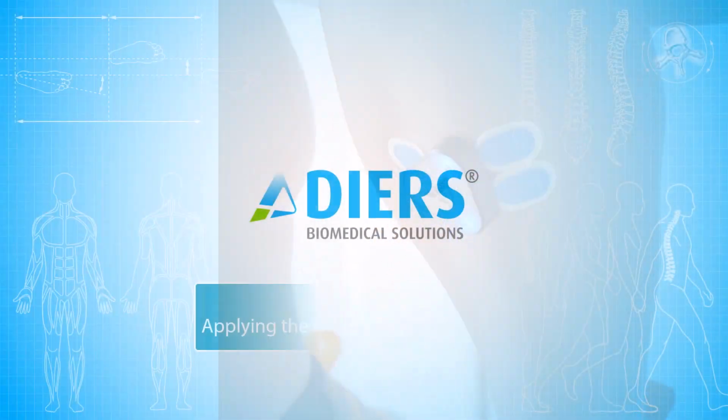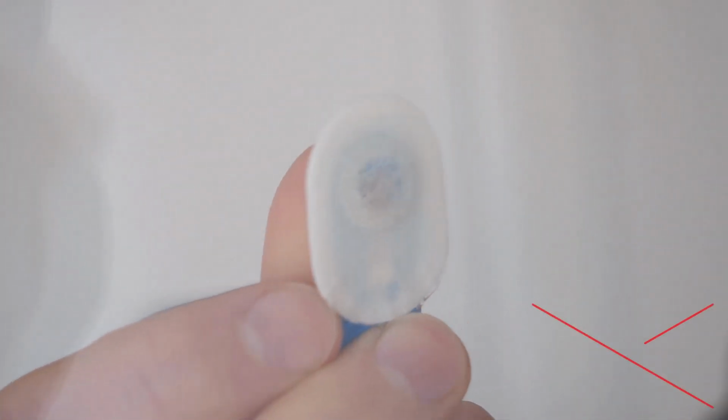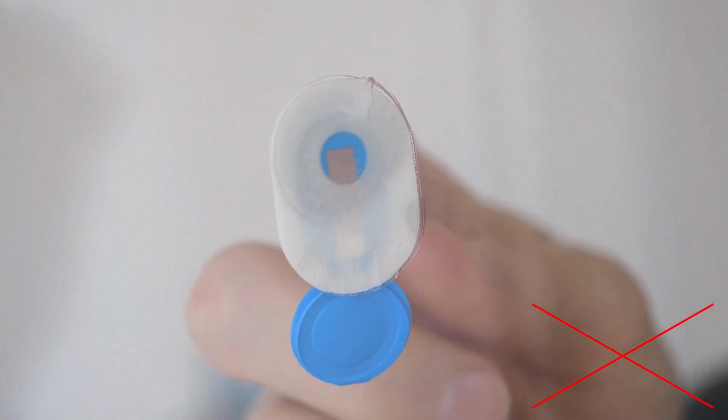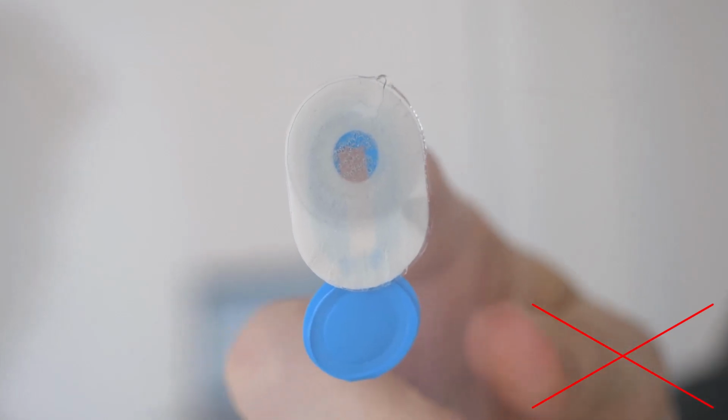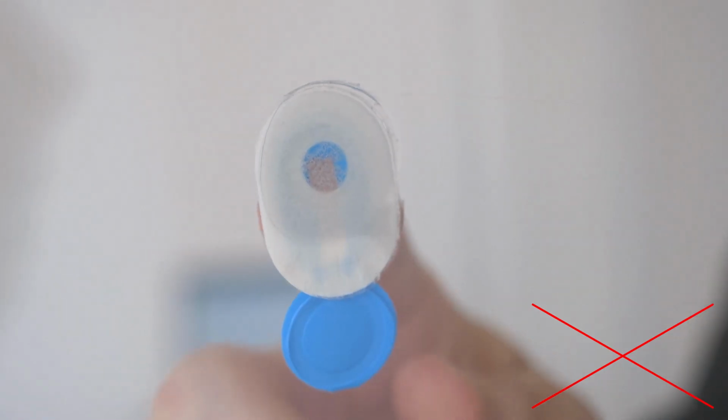We will now look again in detail at how the electrode is pressed on correctly. This becomes particularly clear when the electrodes are attached to a glass, as shown here. First I show how it should not be done. If I press with my thumb on the center of the surface of the electrode, you can see how the contact gel presses between the skin and the adhesive surface on all sides. This impairs adhesion and the electrode slips around.